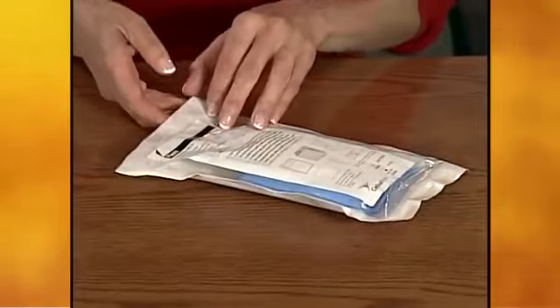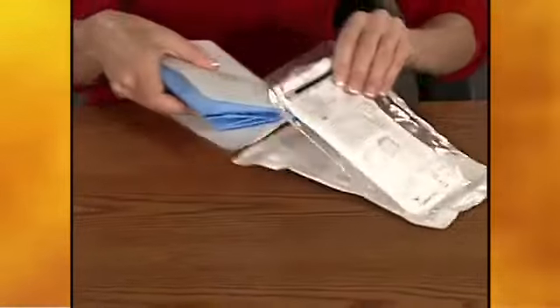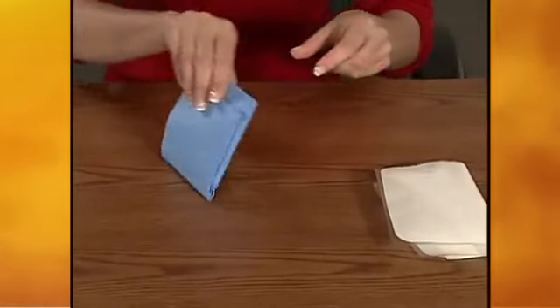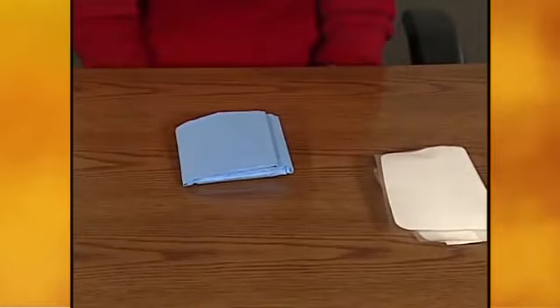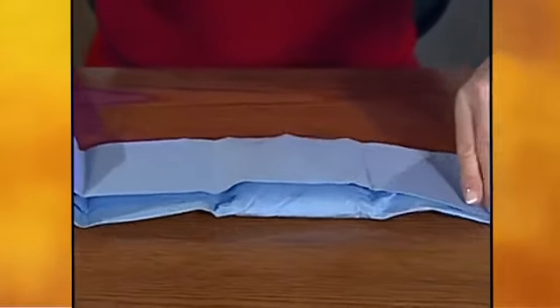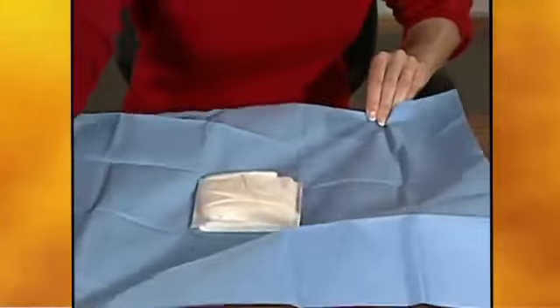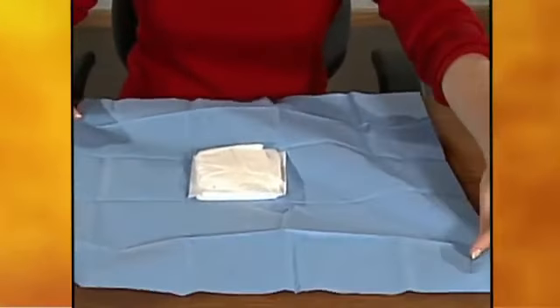Open the procedure pack by peeling the front and the back apart. Set the adhesive dressing aside. Set the blue bundle on the workspace keeping the folded side up, then unfold the blue wrapping. The inside of the blue wrapping provides a clean work area. Remind your patients that the items inside are sterile and should avoid being touched.